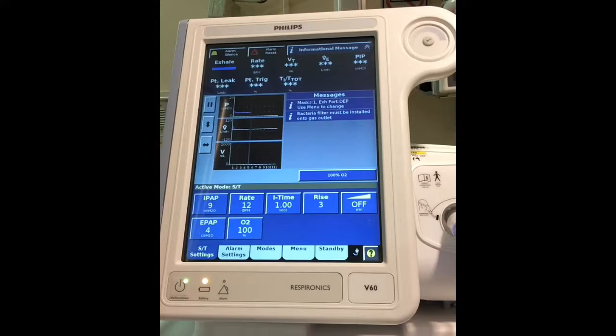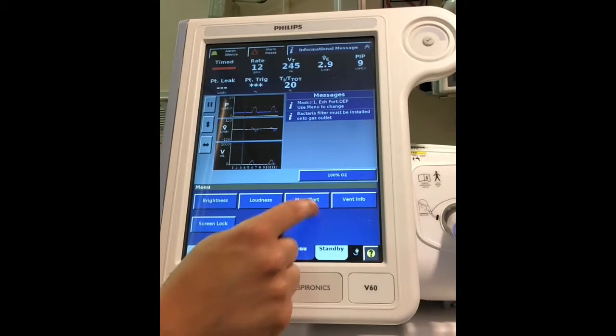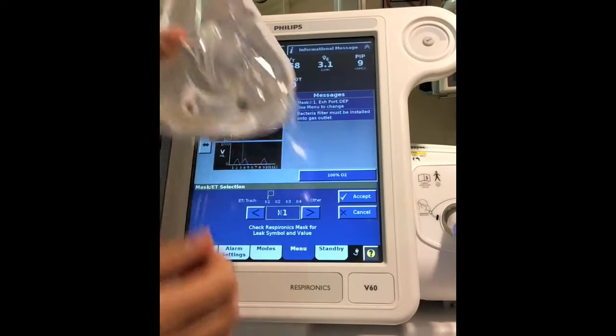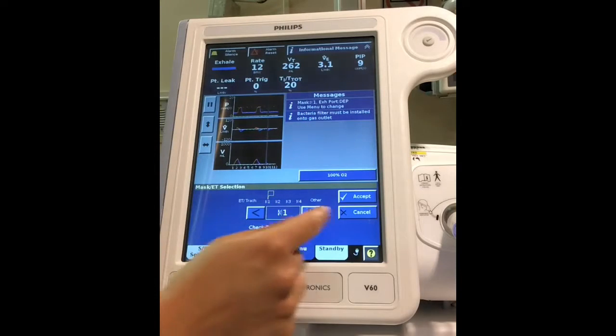Okay, this is the first screen that pops up. You're going to want to hit your menu tab down here. All your tabs are located at the bottom, and all your patient readouts are up on top. So I hit my menu, then I want to hit mask and port. Now you want to find your mask that you're going to be using and find the number value that's on it. You can see right on the elbow that there's a number 1. So I want to select my number 1.